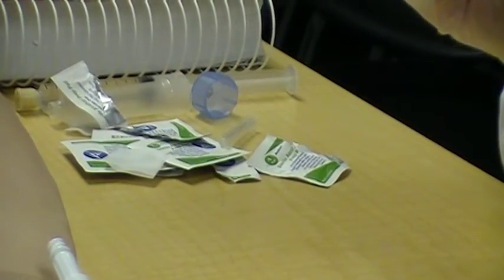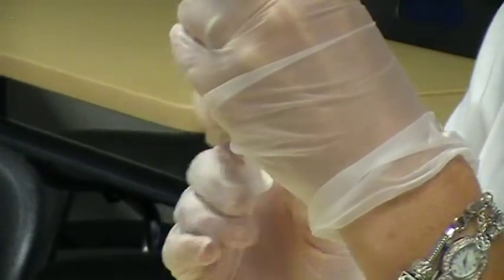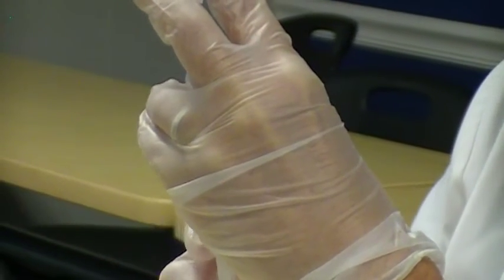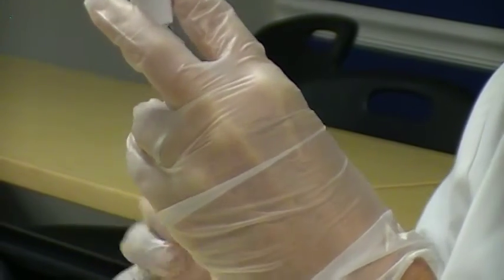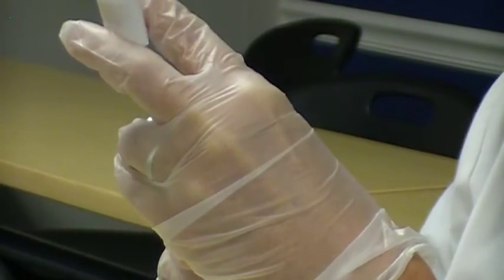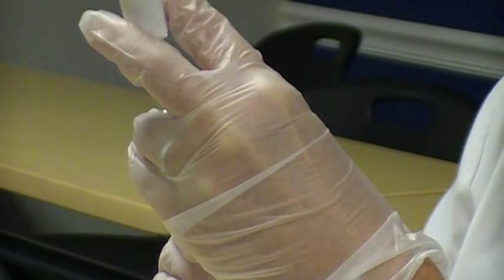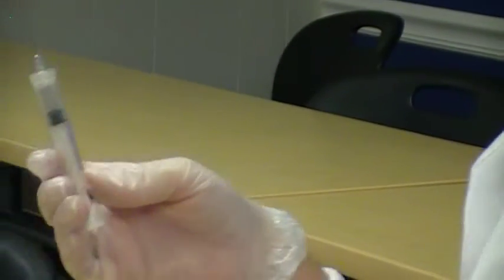Put our 1 milliliter of air in, draw out our 1 milliliter of medication. We do not want any air in here since we are going into the venous system.